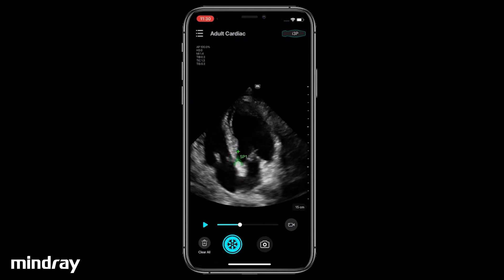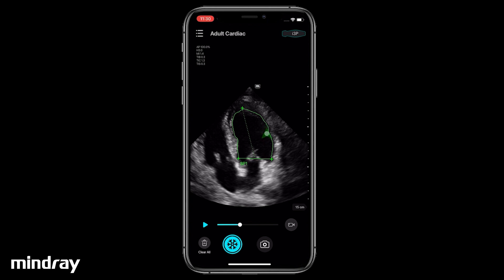Drag the first cursor to the mitral annulus septal. Drag the second cursor to the mitral annulus lateral and tap to set. Adjust the position of the third cursor to be at the apex. While the tracing is still green, you may adjust the trace contour along the endocardium. Once satisfied, tap outside the trace area to set the measurement.